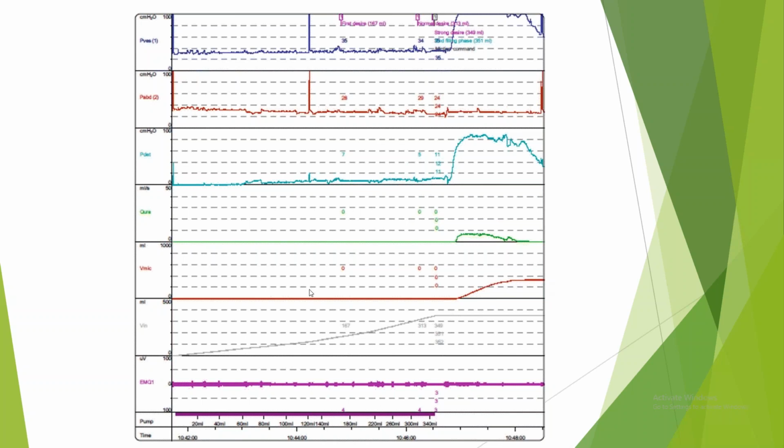Okay, so there is residual. No, the voided volume is 350 only. You see, it is 350. It is actually 200 per line. So the voided volume is good. There is no residual volume. So yes, it can be this also, because of outlet obstruction, because she has to strain much.